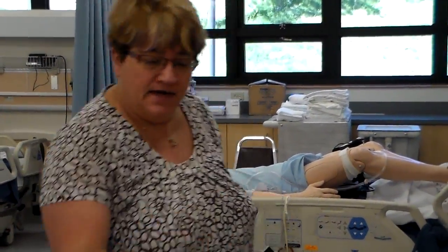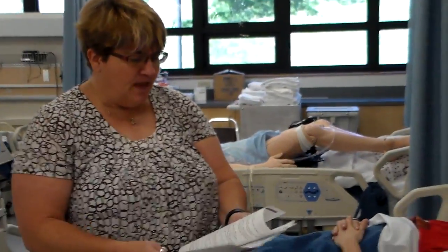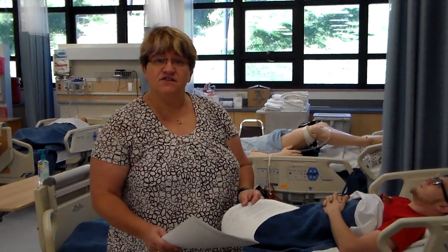So what we're going to do first is transfer between a bed and a chair, and in this case it's going to be a wheelchair. Then we're going to pause the video and transfer a client with a belt, which is a gait belt, we'll show you that in a minute, and 2 nurses. And then we're going to transfer between a bed and a stretcher.